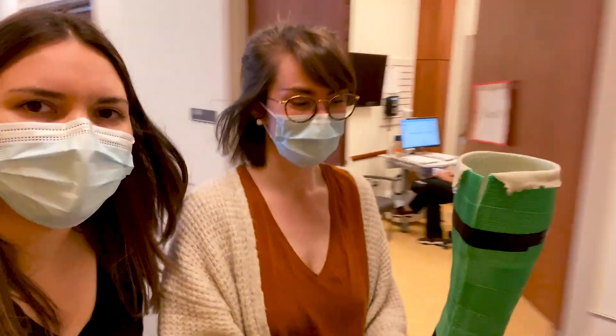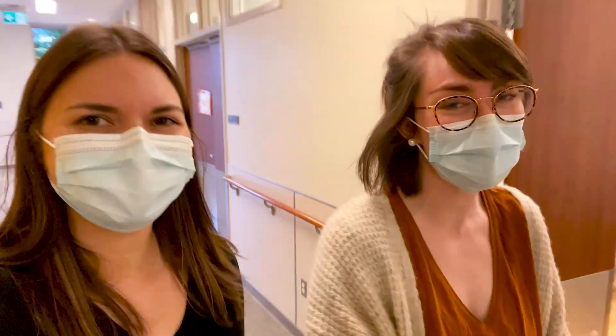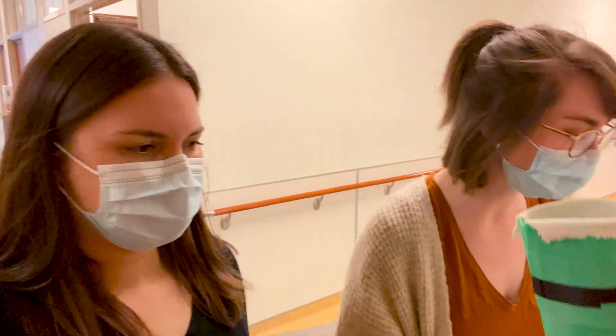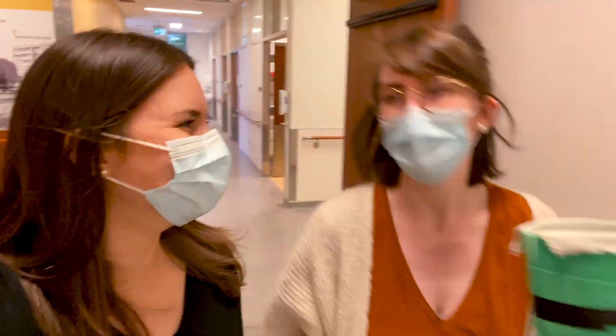We do have a lot of different colors of scotch cast. I always tell patients this one is just for me to keep — they don't get to keep this, so you just choose whatever color is handy. But sometimes if a kid really wants red, I will find red scotch cast and we can cast them in that color.